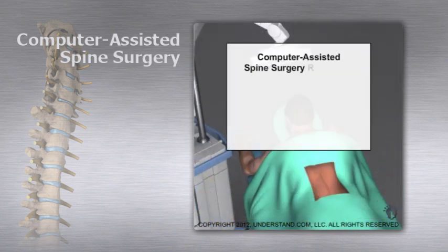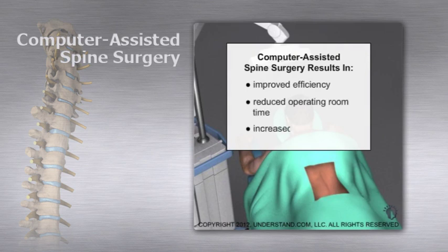Computer-assisted spine surgery results in improved efficiency and reduced operating room time with increased safety in technical spine surgery procedures.